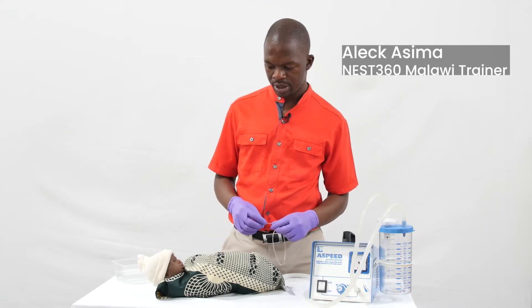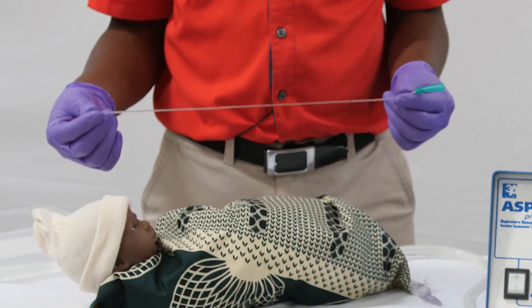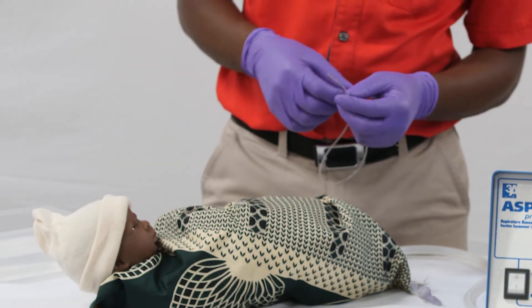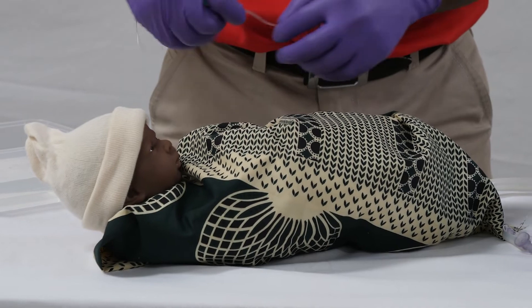When there is a baby who needs suction, you need to use a catheter — either French gauge 6, 8, or 10. You will also need a piece of tape and a container with some clean water. Then measure the suction depth on the catheter.